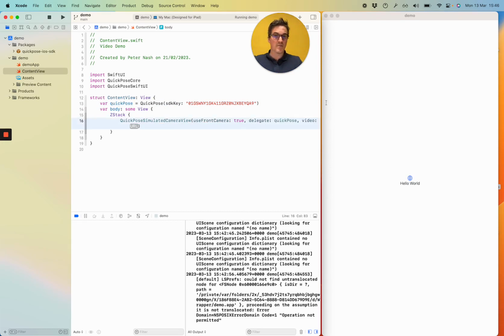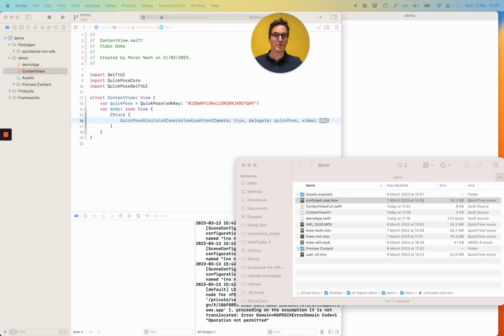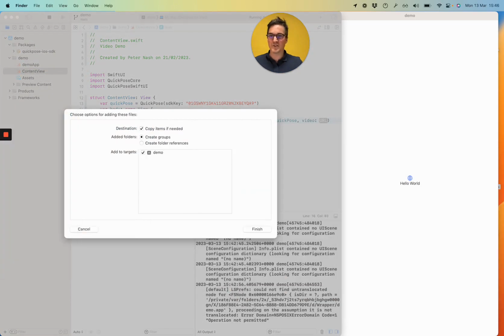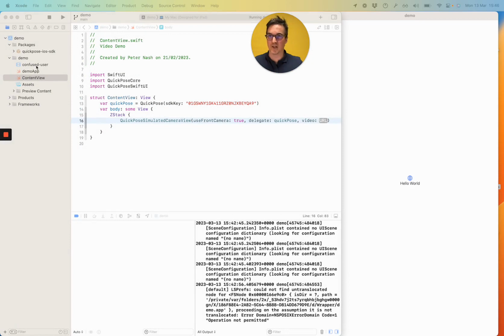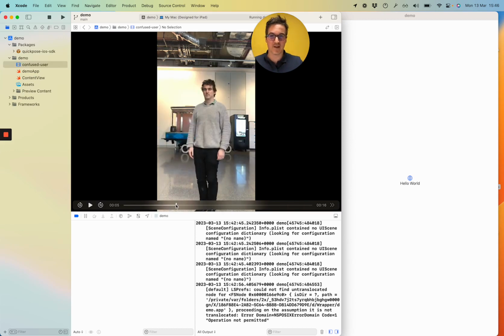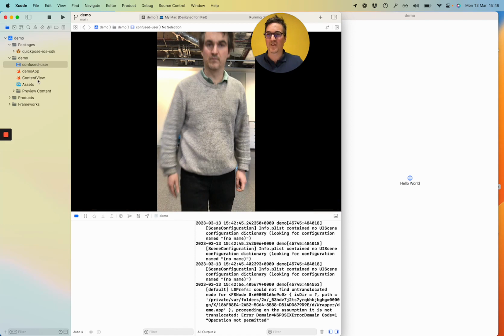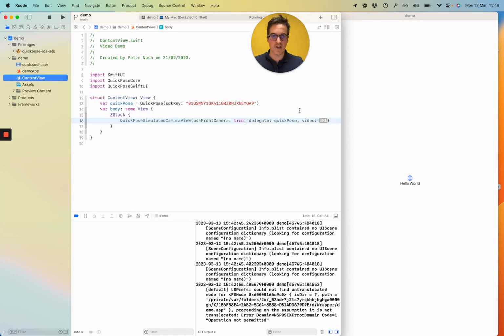Cool. The simulated camera view takes a video. So I've recorded a few videos in advance. I'm going to start off with quite an interesting choice. You might be like, why am I using this video? This video is, I've called it Confused User. Now you'll sort of see why I do this. But the general gist of it is I stand back and I scratch my head for a bit and look confused. So I'm going to load that in now.